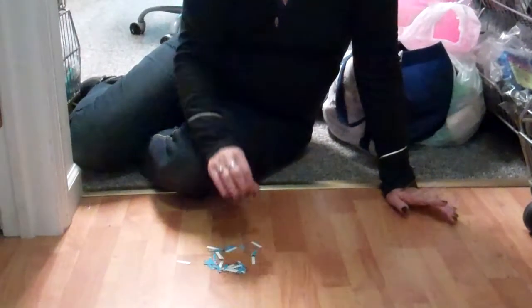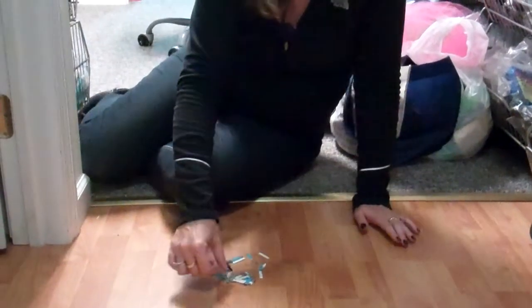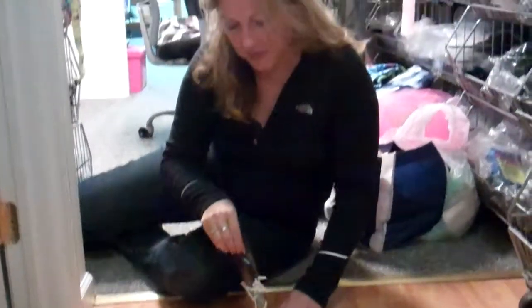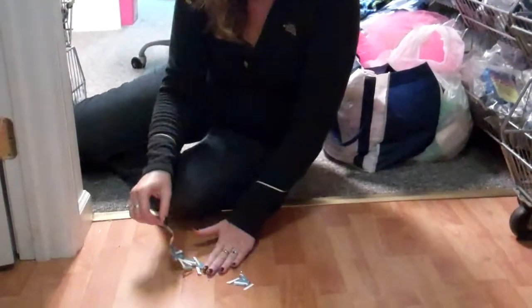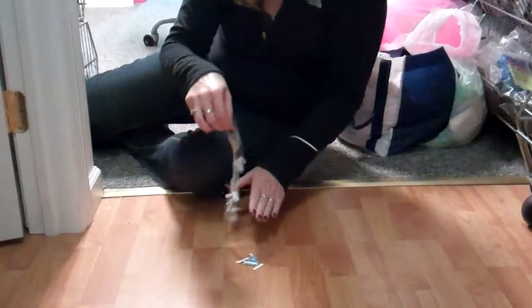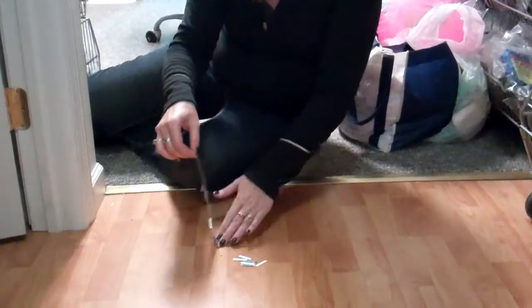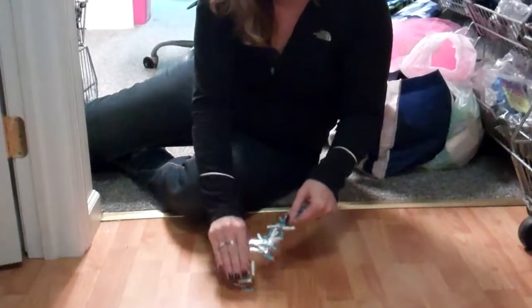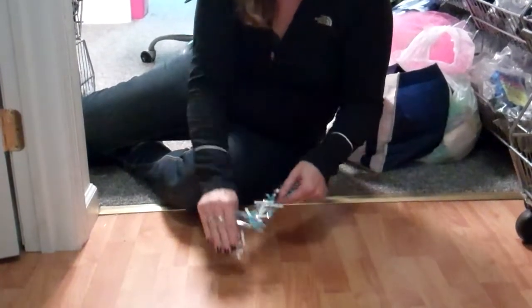So I found a really easy, cute way to pick them all up. Just take a piece of tape and stick it on the floor, and you can pick up all these test strips really quickly. Ta-da! Test strips.